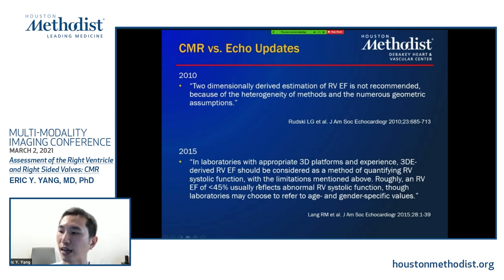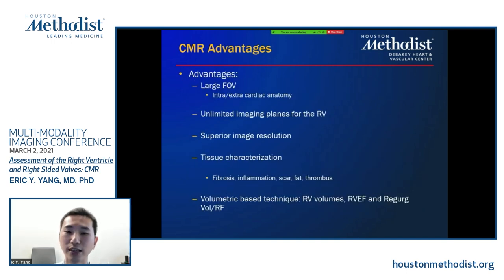That has changed now that 3D techniques are evolving with echo, and I haven't seen any new updates on this, but now 3D echo has been considered comparable to CMR and CT techniques for assessing the right ventricle, although that's an area that's continuing to evolve, and if a center is going to do it, they have to be experienced with it. But when it comes to CMR, CMR actually does have some advantages.